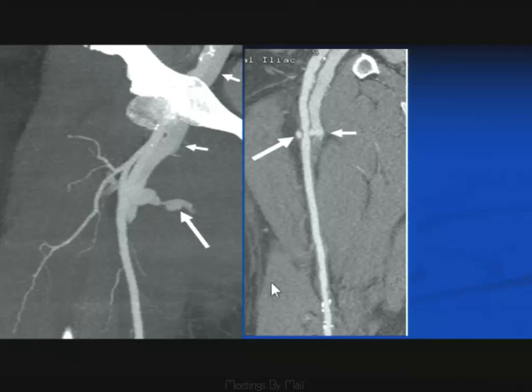So here's an example of an aneurysm of the femoral artery. And importantly, I think this is a post-trauma case and post-cath. What we also demonstrated in this case was an arteriovenous fistula. And that, of course, obviously is important in terms of management here. You don't want to do aneurysmal thrombosis in a patient with an AV fistula.